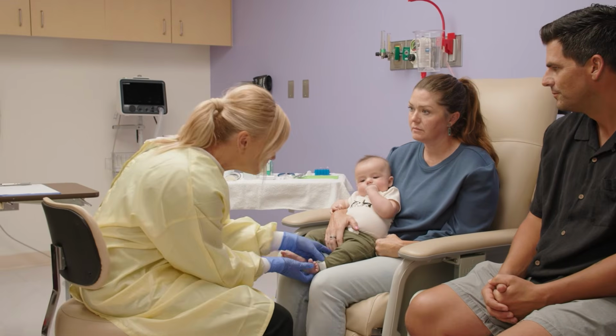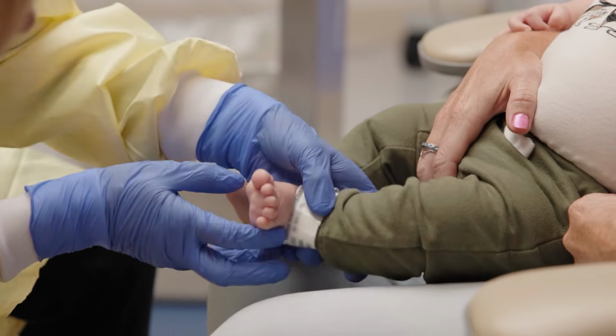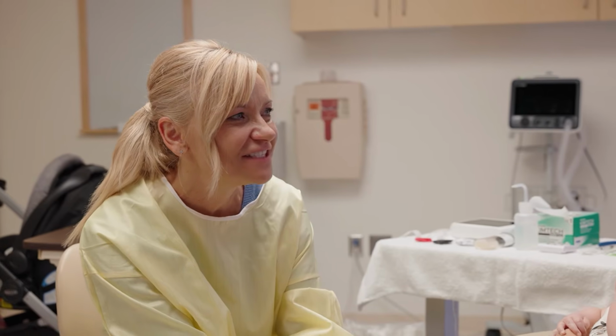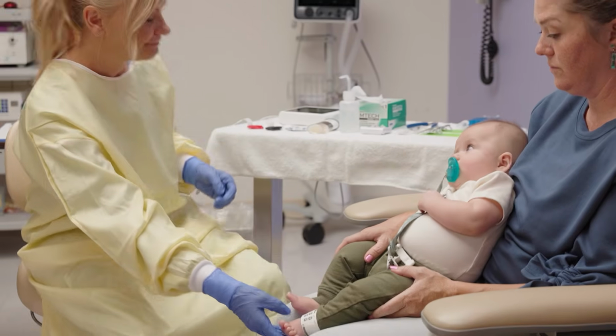Before starting the sweat test, it's important to confirm the patient's identity with 2 identifiers to make sure the specimen is collected from the right patient. For infants and small toddlers, having a caregiver hold the child during the procedure can be very helpful to offer comfort, help keep the child in position, and allow the caregiver to assist in keeping the arm still. If holding the child isn't feasible or preferred, laying the infant on an exam table is also an appropriate option.